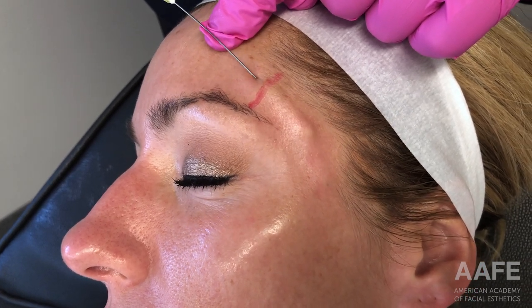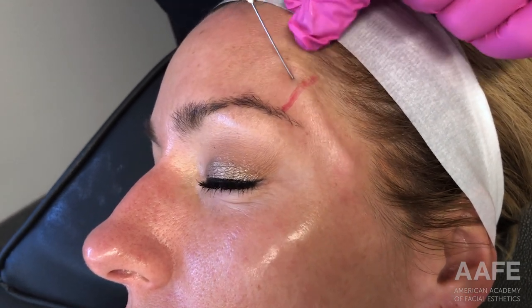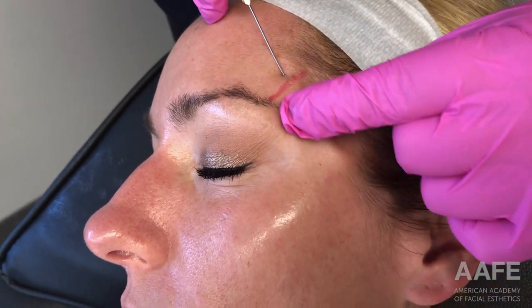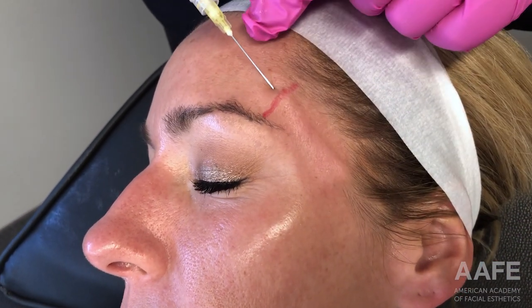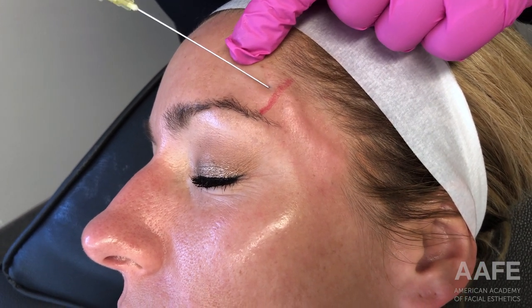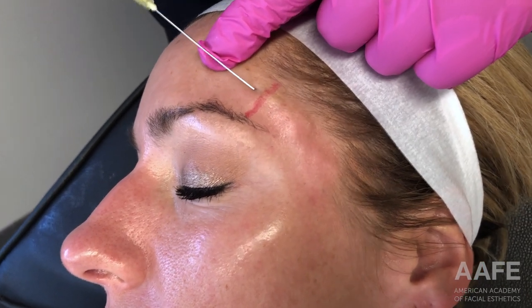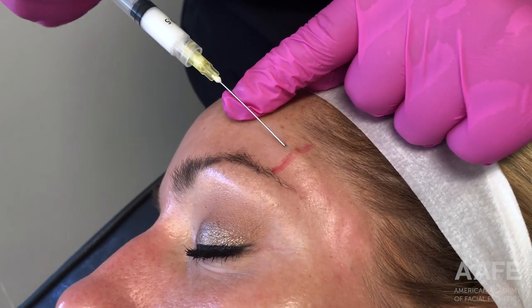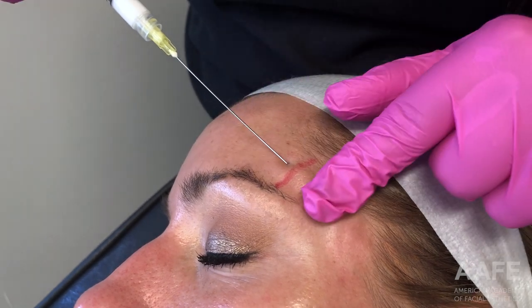I have chosen to use a cannula here. Anytime we do dilute or hyper-dilute Radiesse, we are always fanning the product, so we always use a cannula. I specifically like cannula in the temple area because it tends to be safer — there is a lot of important anatomy and vascular structures there, and I feel more comfortable using a cannula rather than a sharp instrument. That is why we have decided to use this top-down approach coming through the temporal fusion line into the pocket of the temple.